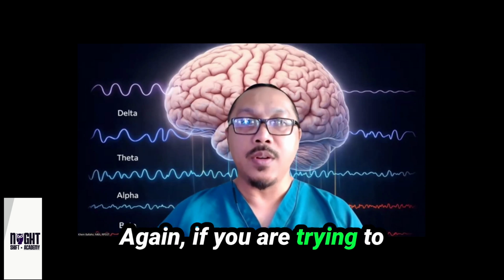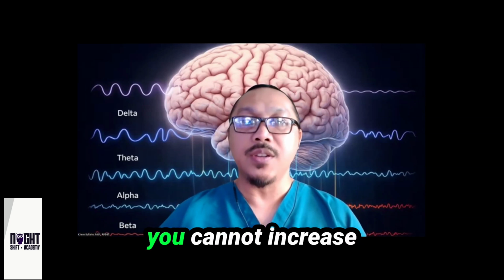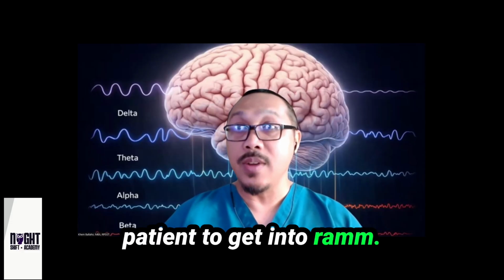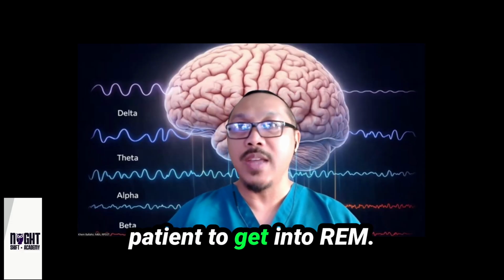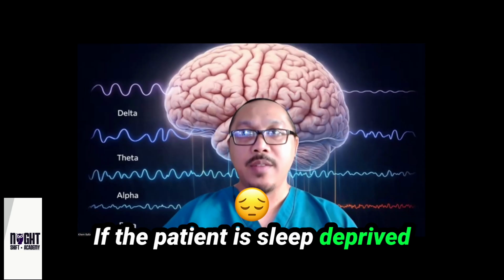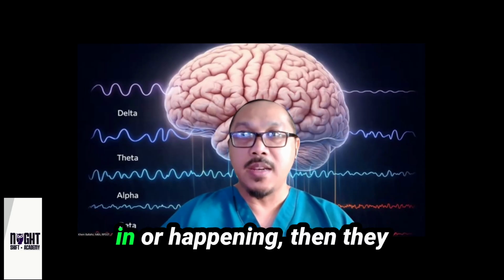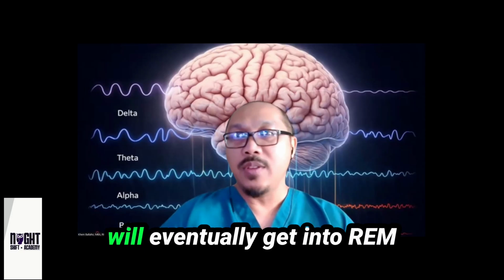Again, if you are trying to reach optimal titration, you cannot increase pressure just because you're trying to force the patient to get into REM. You cannot force a patient to get into REM. If the patient is sleep deprived and you open up the airway, there are no arousals happening, then they will eventually get into REM.